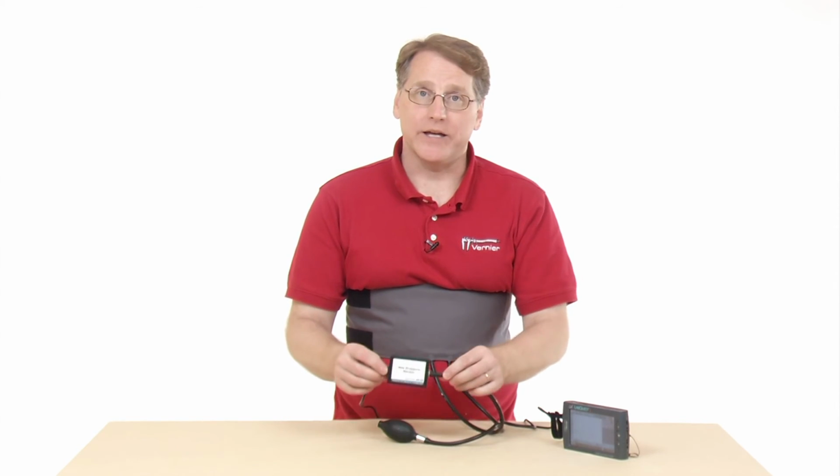So again, the respiration monitor belt is an accessory that you can add to the gas pressure sensor to measure human respiration. So if you are doing physiology labs that require that, then that would be the tool to use.